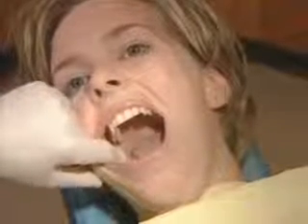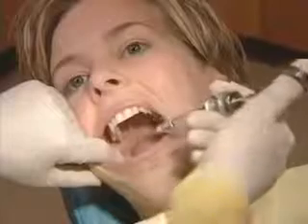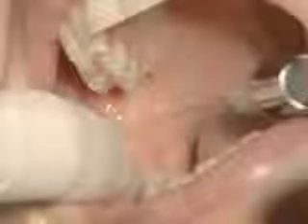The height of insertion will be roughly the midpoint of your fingernail, anywhere from the midpoint to the height of your fingernail, and that determines the correct height of insertion. After palpating the landmarks, you will be inserting the needle into the pterygo-temporal depression. The needle is brought in from the contralateral side, and the insertion point is directly there. Advance slowly until you go 25 millimeters.